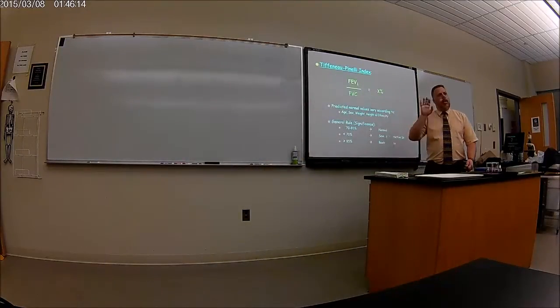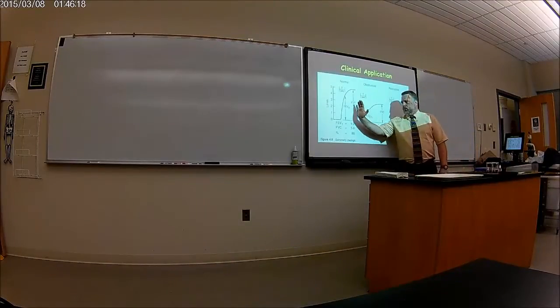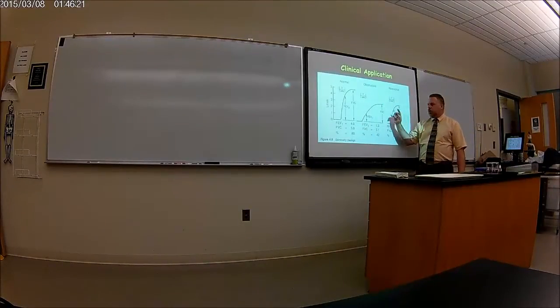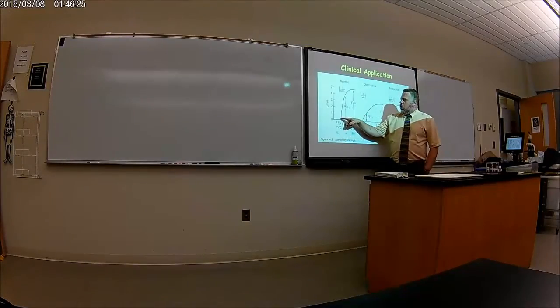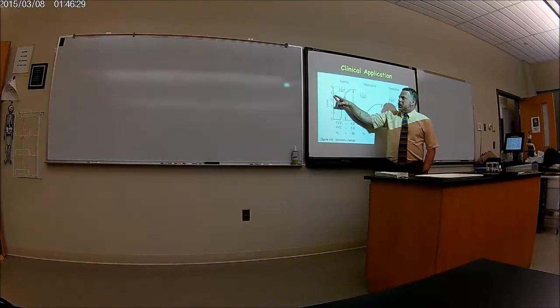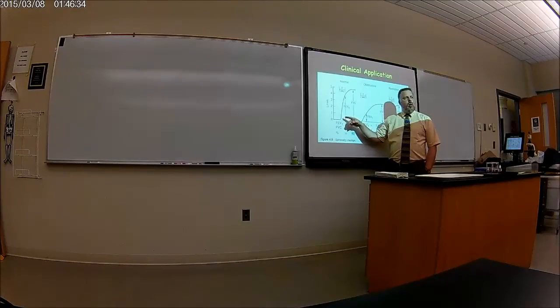You put pencils down. Everything is on here in this graph. Okay? Forget about these pictures for the moment. Just look at what's going on here. You're going to blow out all the air. So here's where liters are, let's say 5 liters, and this is over time. So you're going to blow out everything.